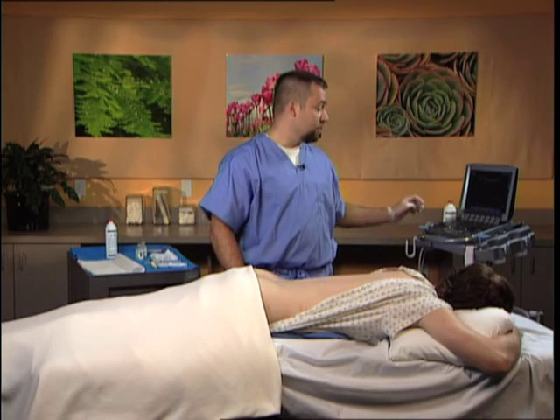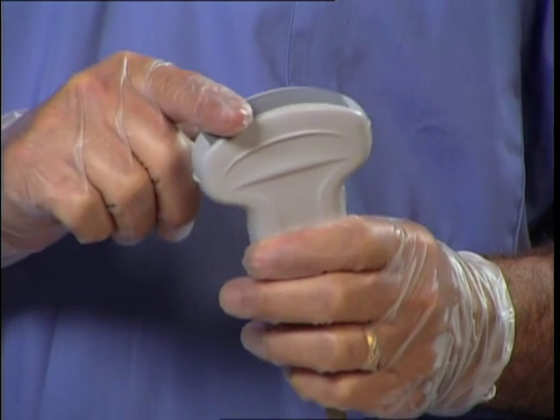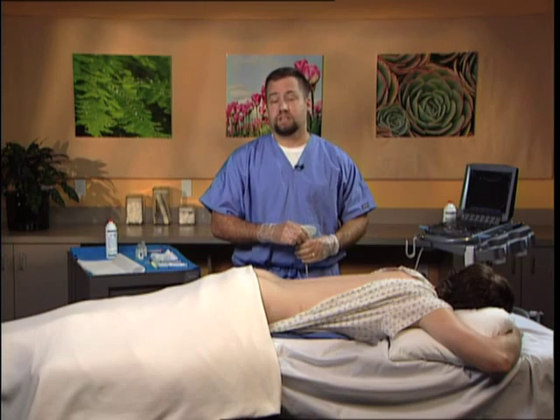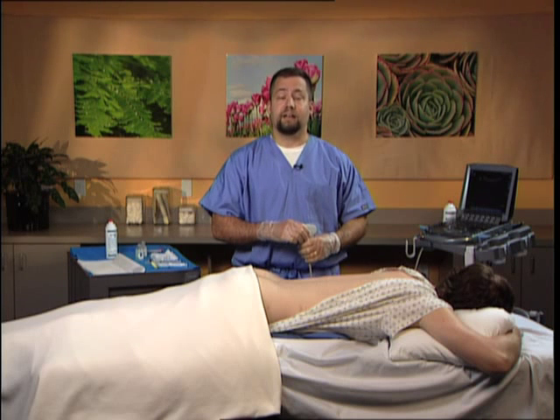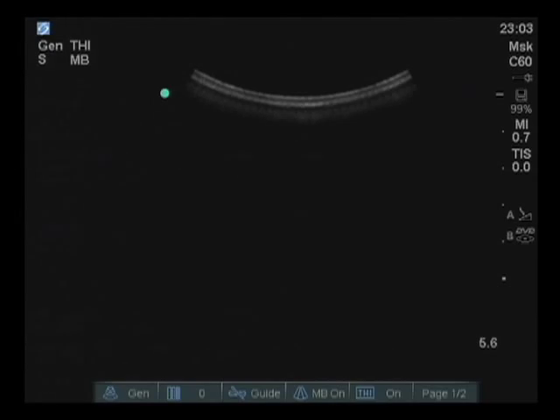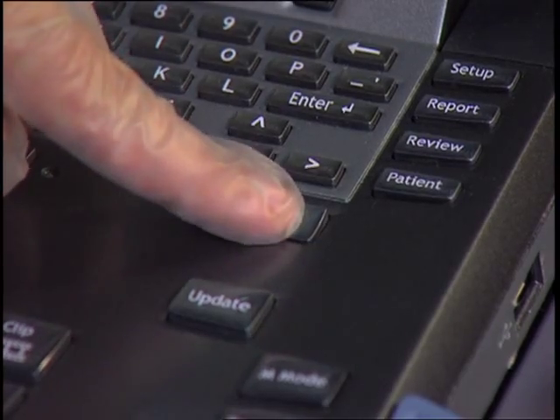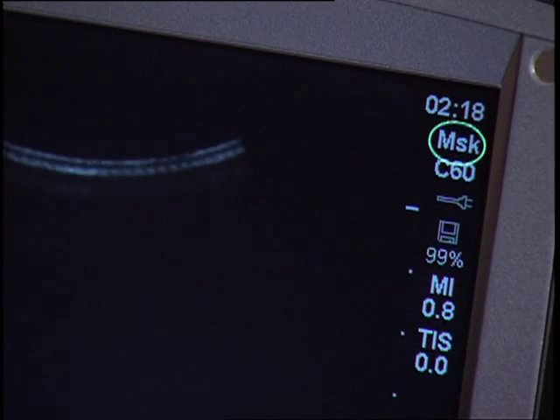In this particular case, I'm going to be using a Sonocyte C60 probe because of its curvilinear shape, which will facilitate viewing of the sacral anatomy. This is key for the demonstration of the relevant anatomy and ultimate placement of the needle for successful completion of the procedure. The settings are set for 5.6 cm depth — obviously this is patient specific, as a larger patient may require a deeper depth. The other setting is the musculoskeletal, or MSK, setting, which provides the best bony enhancement.